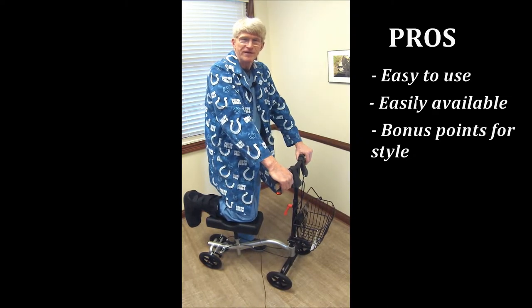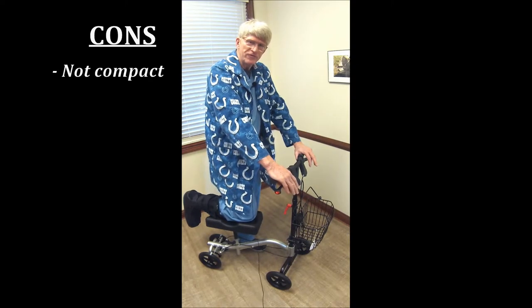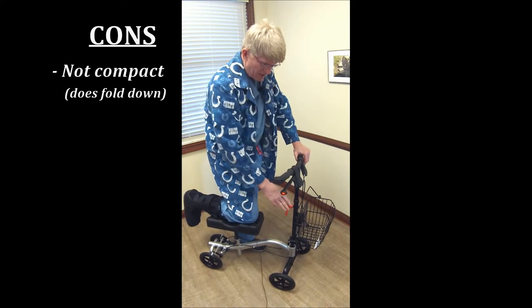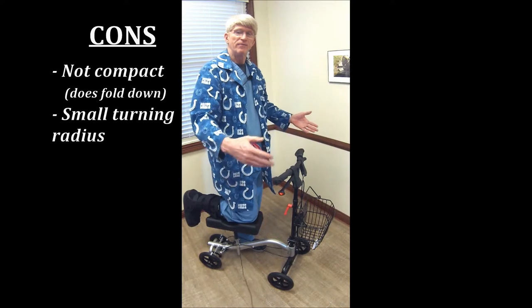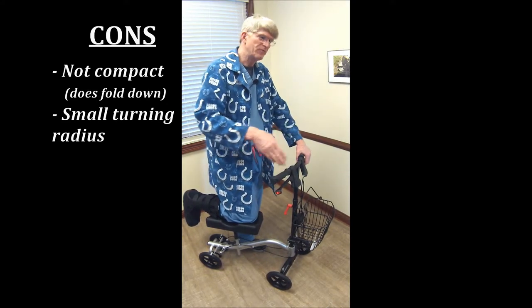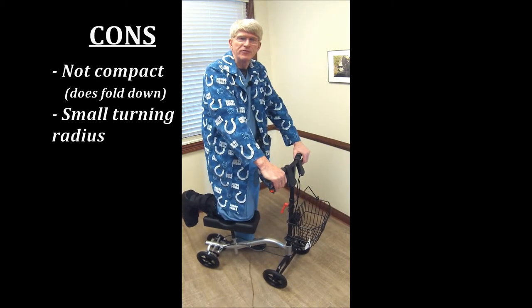What you have to be cautious of is they're not really compact, so if you're traveling with these, just be aware and check out the space you have available. The steering mast does fold down to some extent, but just be cautious when you travel. The turning radius — the wider and more stable it is, that's good, but that affects the turning radius. So expect to do a lot of three-point turns, moving forward and back. It's like backing up a trailer.